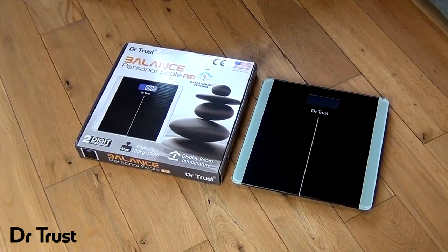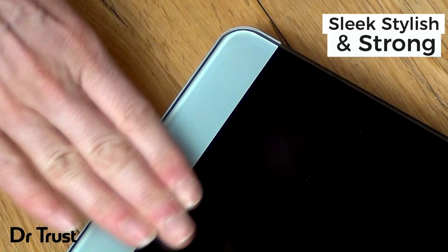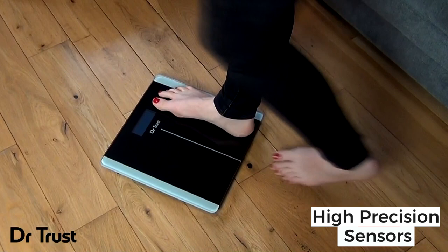Introducing the Dr.Trust Balance Personal Scale 513. The simple, easy and reliable way to keep track of your weight at home. Sleek and stylish, this tempered glass scale suits any home decor and boasts high precision strain gauge sensors for accurate readings every time you weigh.